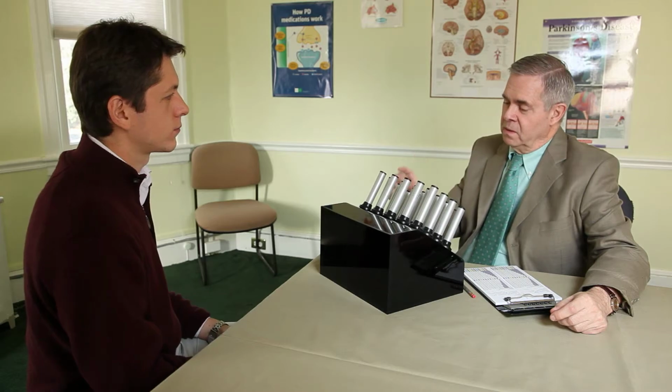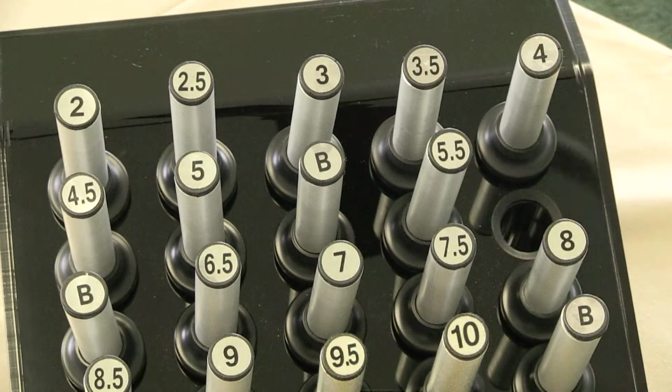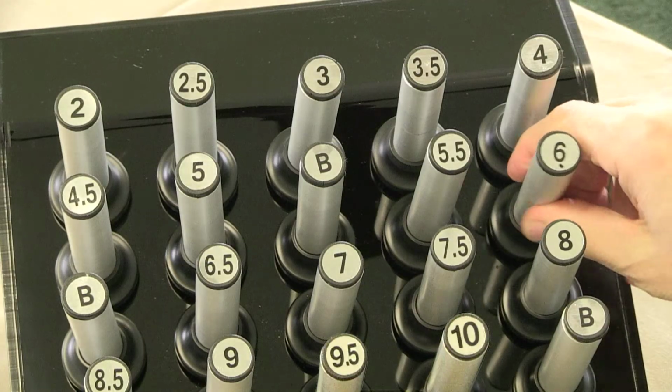Today we're going to be testing how well you can smell, your sensitivity to odors. And what I'm going to do is present two stimuli to you. For example, here's the first one, and here's the second one.